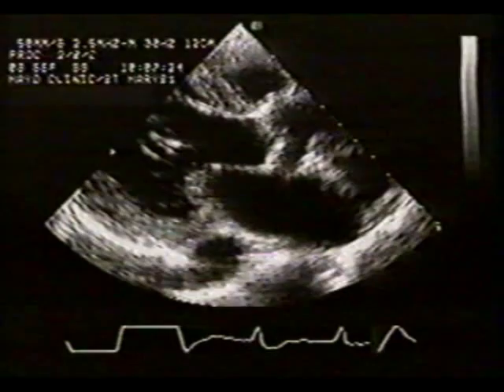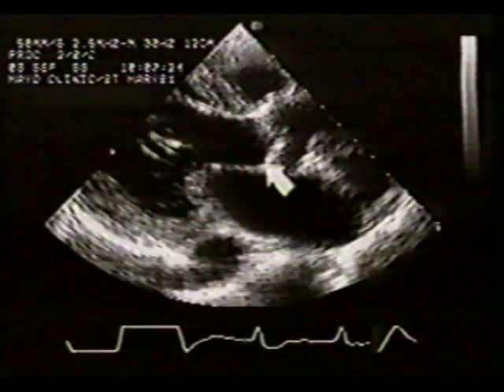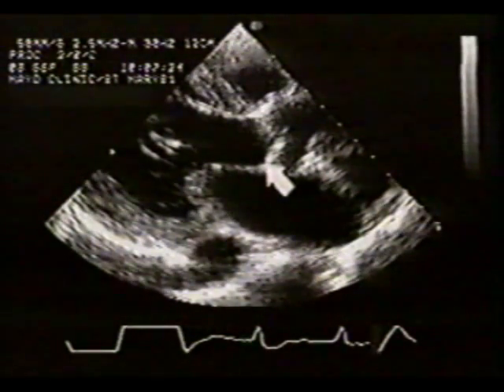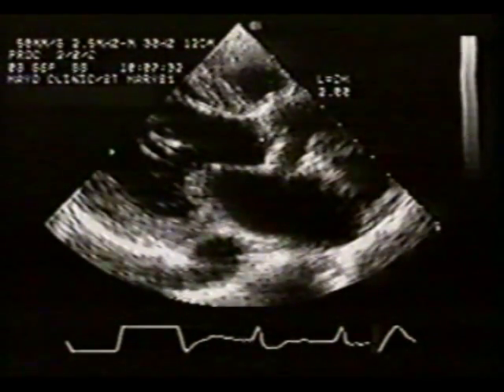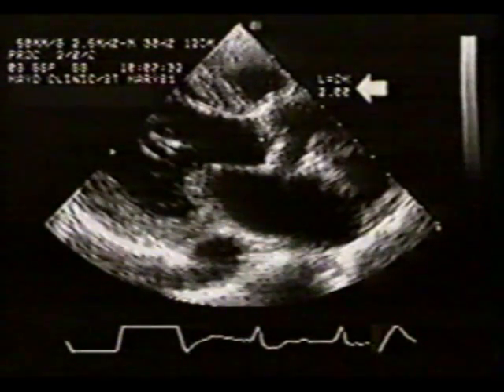Now the posterior caliper will be placed here at the junction of the posterior aortic cusp with the anterior mitral leaflet. The left ventricular outflow tract diameter is 2.0 centimeters.